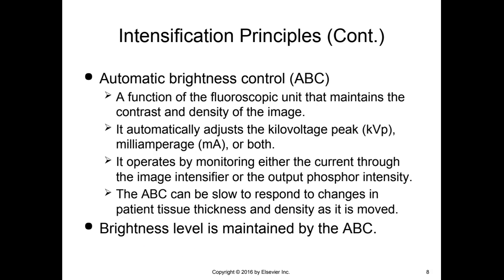All right, this should also be a review, automatic brightness control. I think it's a review. It may not be a review for you. But basically, our automatic brightness control is an automated feature for our fluoro tower, and it controls the technique for the radiologist as the exam is in progress.